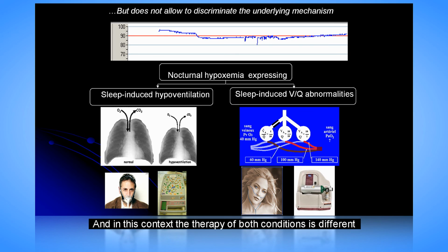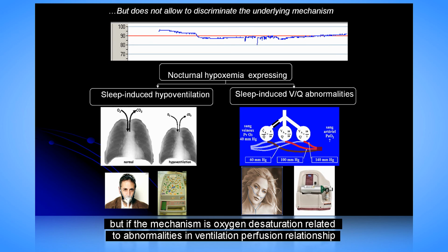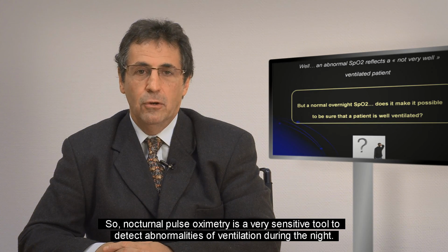And in this context, the therapy of both conditions is different, because if you have a residual hypoventilation, you have to increase the amount of ventilation. But if the mechanism is oxygen desaturation related to abnormalities in the ventilation perfusion relationship, the more pathophysiological treatment is to add oxygen to the ventilator. So, nocturnal pulse oximetry is a very sensitive tool to detect abnormalities of ventilation during the night.